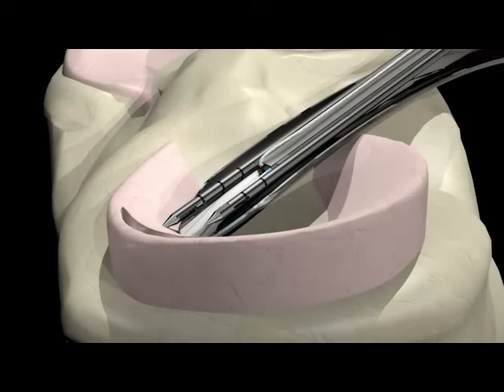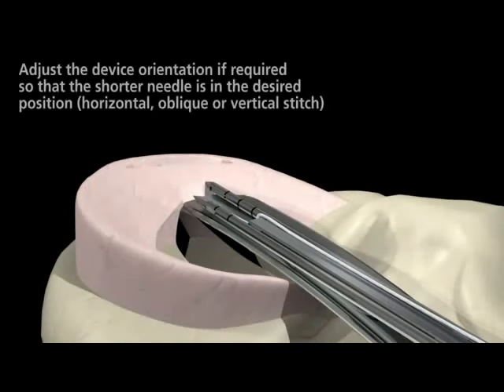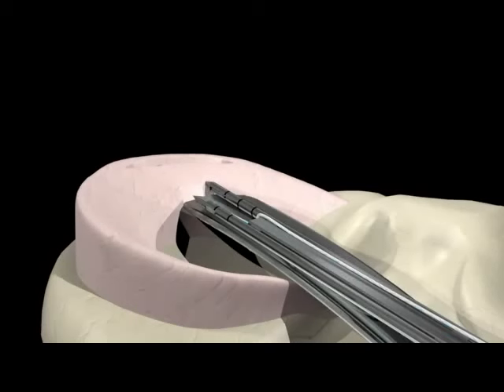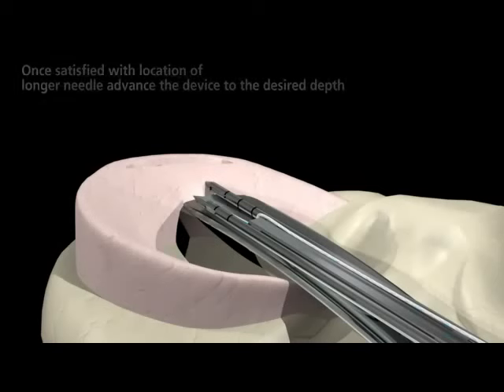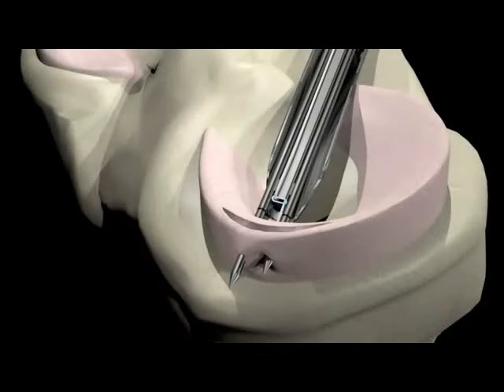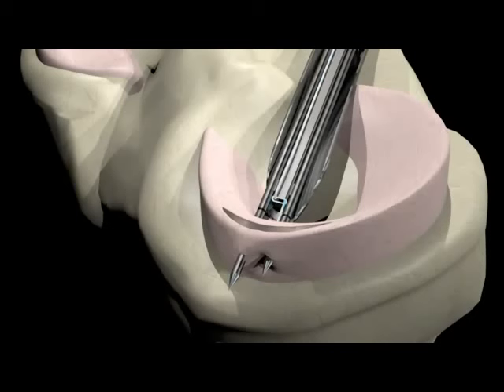Advance the longer needle until it just penetrates the meniscal tissue. Adjust the device orientation if required so that the shorter needle is in the desired location, positioned for a horizontal, oblique, or vertical stitch. Fully advance the needles to the desired depth. Note: the markings on the needles are at 5 mm increments, allowing for the predetermined depth of penetration found in step 2.